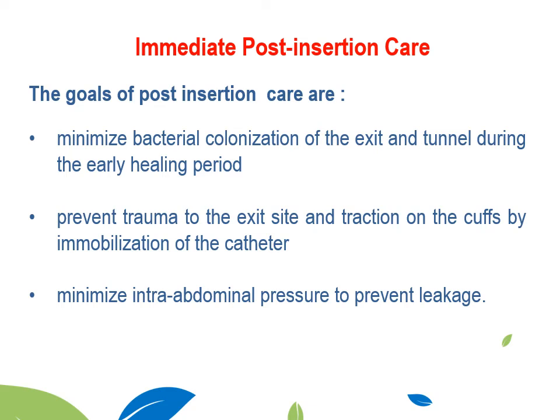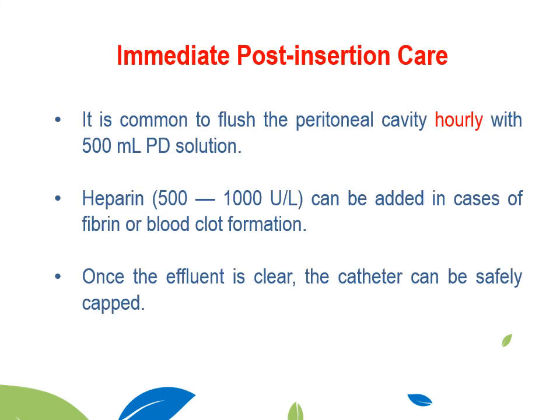After insertion of the catheter, we have some goals to keep ahead. So we have to minimize bacterial colonization. We have to minimize and prevent trauma to the exit site or any traction on the cuffs, especially as they are going to grow fibrous tissue. To stabilize the catheter in place, you have to secure the movement of the catheter well, and you have to minimize intra-abdominal pressure to prevent any leaks and avoid later complications. How to manage that is somewhat difficult, because you have to rest the patient for an extra 4 weeks till the cuffs of the catheter start sealing the peritoneum.